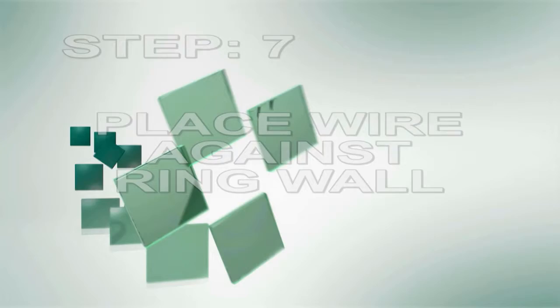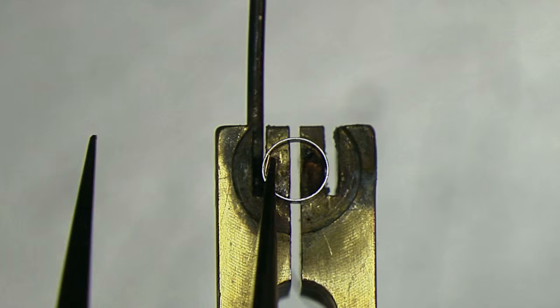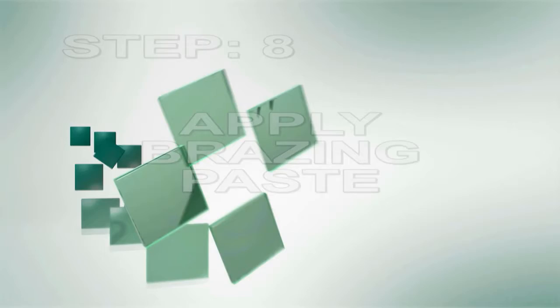Step 7. Place wire against ring wall. Ensure the stripped wire is snug against the ring wall so they are firmly touching. This will help create a strong connection.